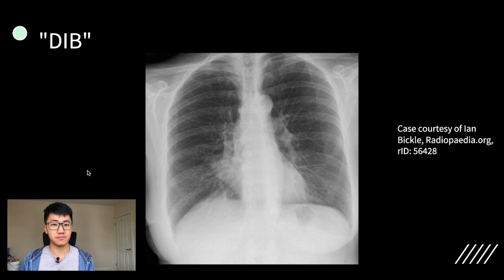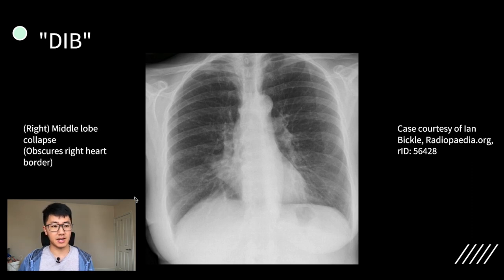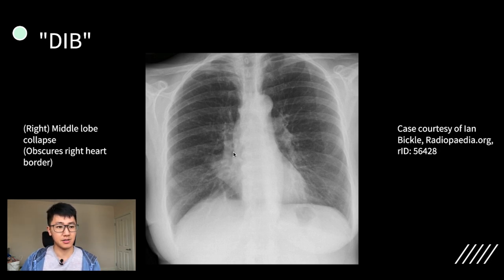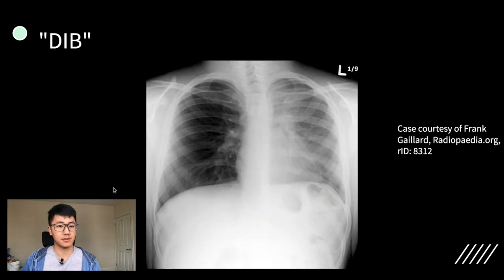Next case — so this is middle lobe collapse. It's quite a tricky one to spot, but again you have got this almost triangular opacity. Because the middle lobe is adjacent to the right heart border, as we saw with the consolidation case, it will obscure that right heart border, so it's not as crisp as on the other side.